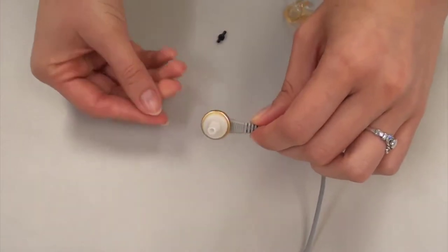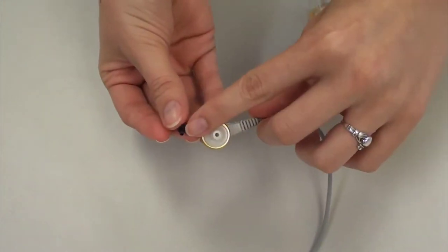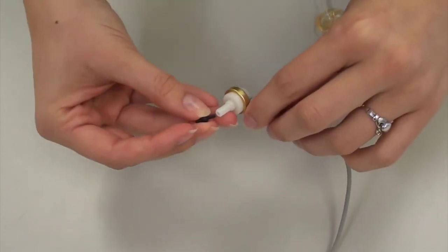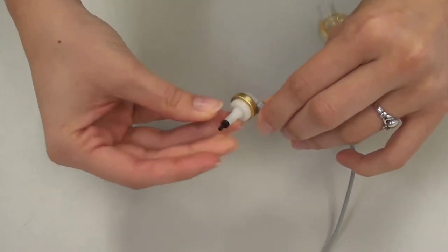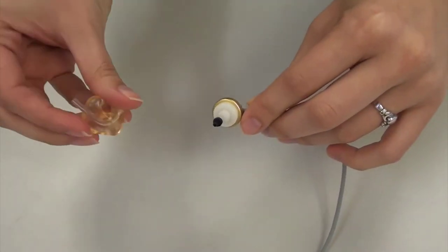First, attach the white ear tip to the end of the button receiver. Then attach the black tube nipple to the white ear tip. You can then insert the nipple into the ear mold tubing.